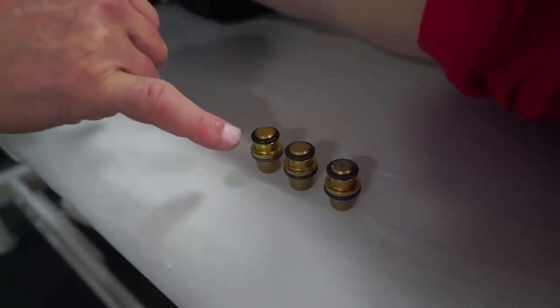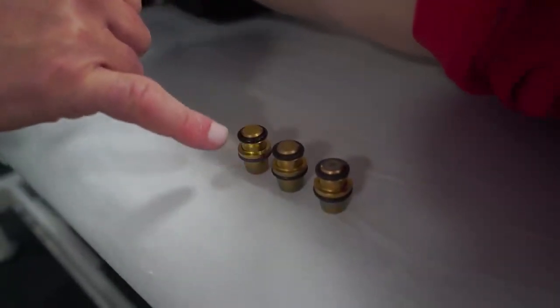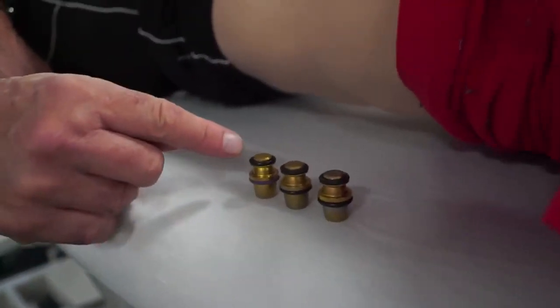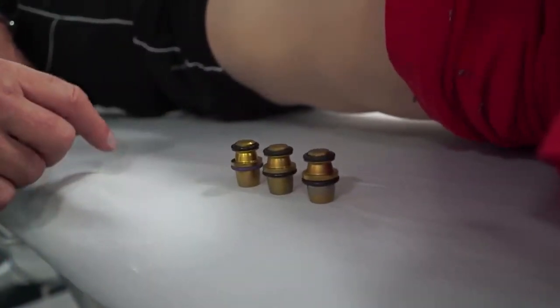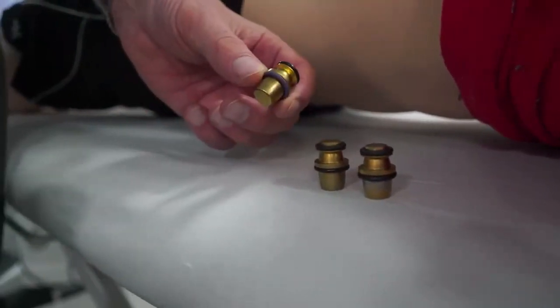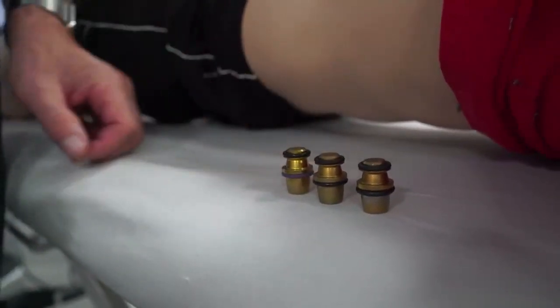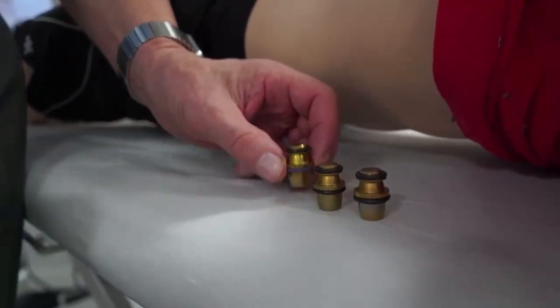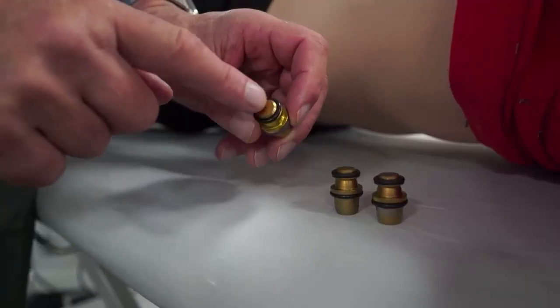So one thing that we need to look at is these O-rings. Have they become perished? You'll see that because they'll be white and have little cracks in them. And you're given a pot of these O-rings so that you can replace them. But for you to have a look at is the end here, where the bullet strikes the transmitter.